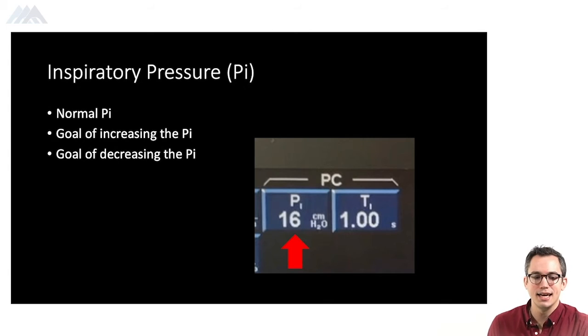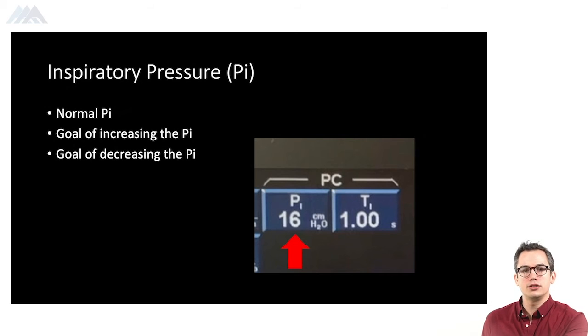Our next setting, inspiratory pressure. When we're setting our inspiratory pressure, that's going to be the initial pressure that we're giving and delivering to our patients that then ultimately is going to give us a tidal volume.